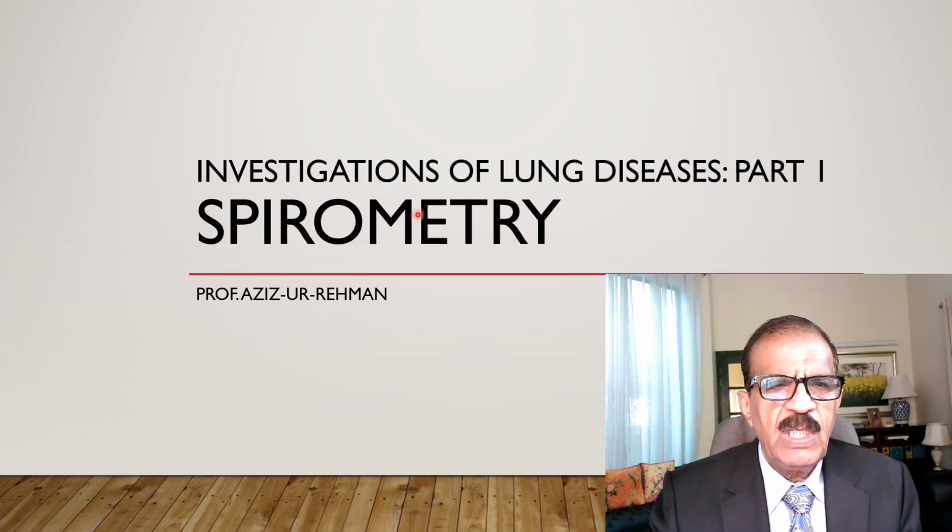Now, before we talk about these tests, let me say one thing: most lung diseases are clinically diagnosable. But of course, spirometry gives you some more insight into the exact nature of the disease and also helps to exactly quantitate the disorder.